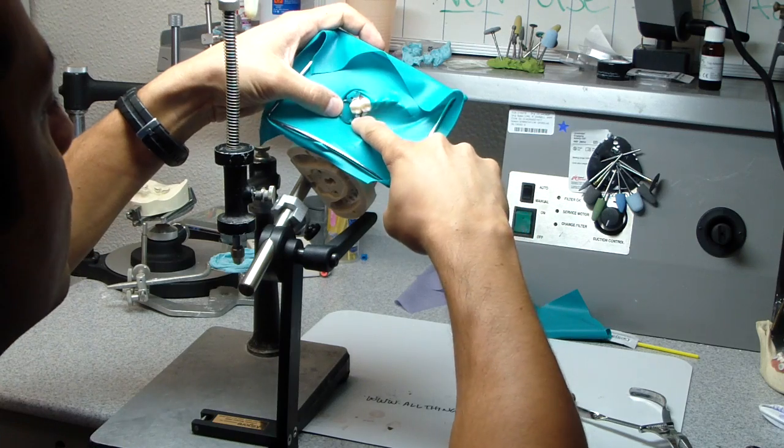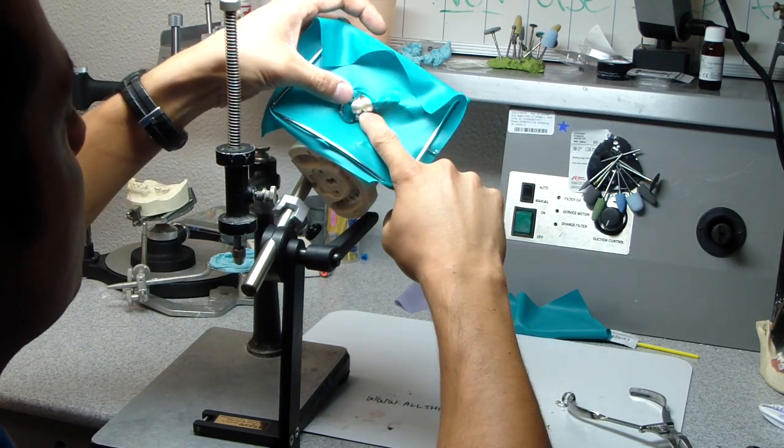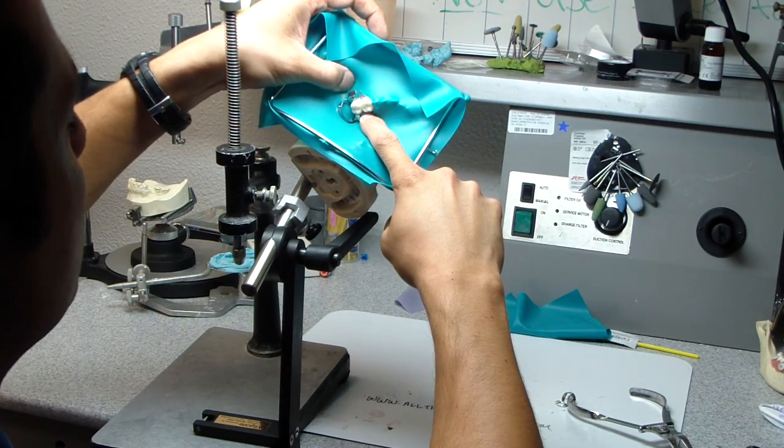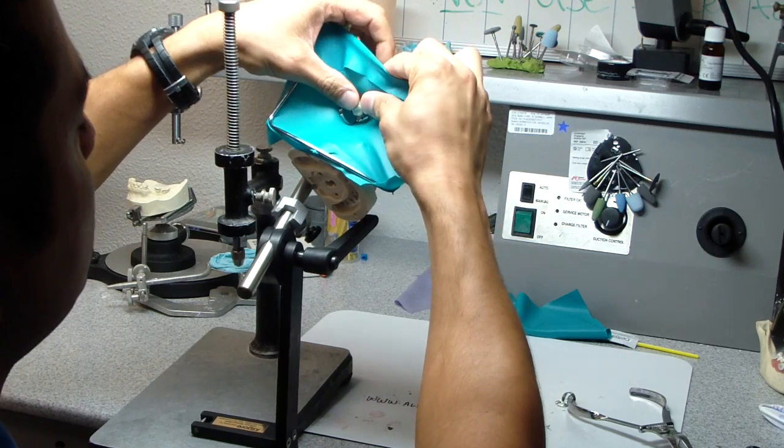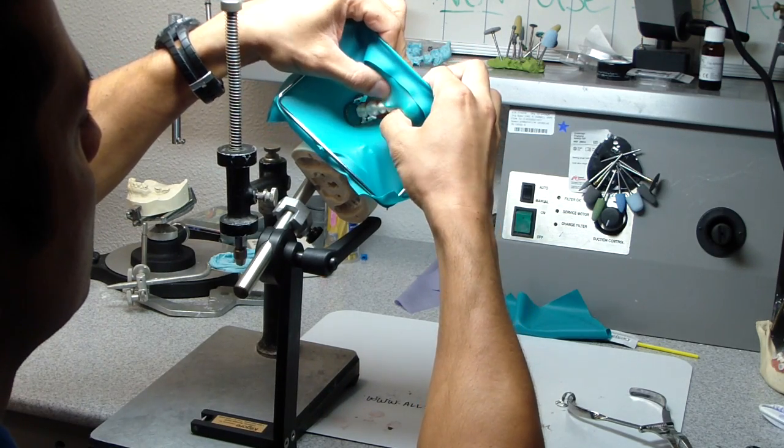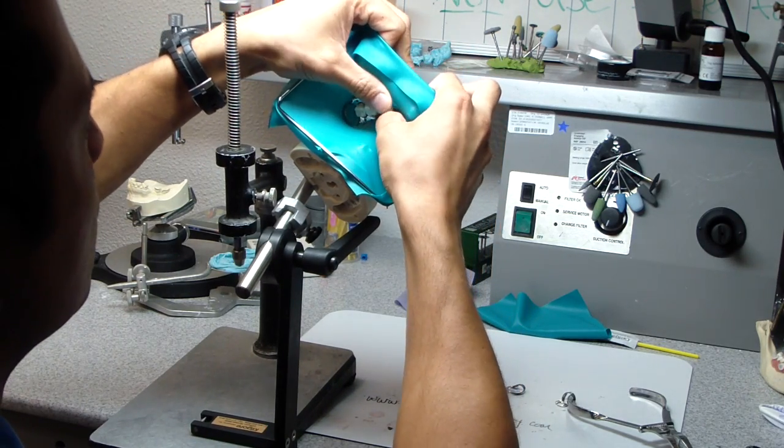Say we're restoring tooth number one, six, or three, and we're going to snap the rubber dam underneath the wings. And then I'm going to pull it forward to whatever I need to.